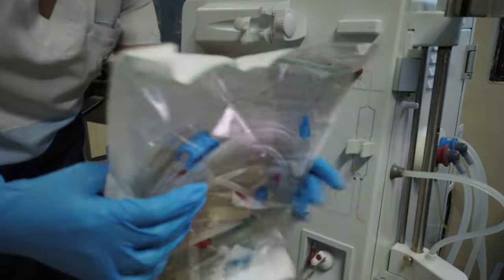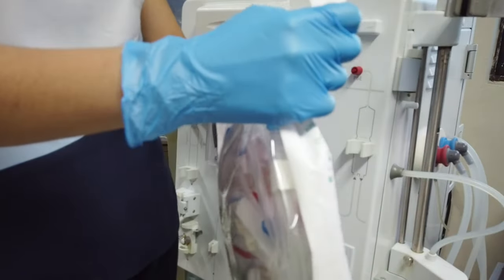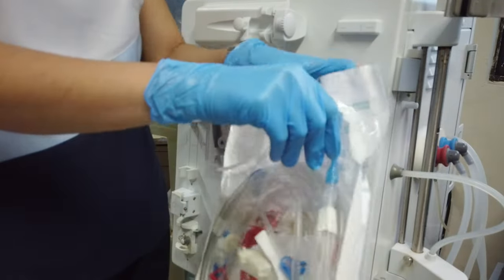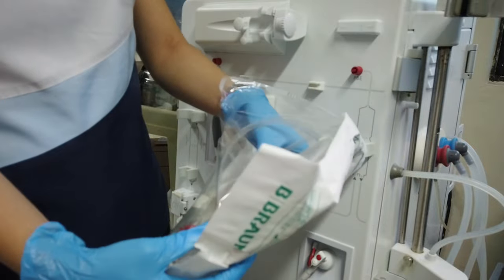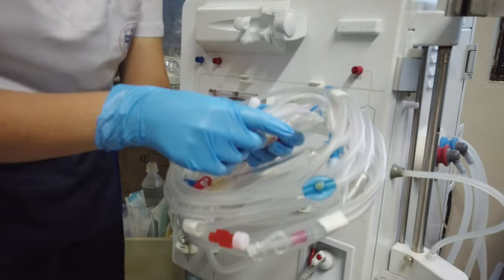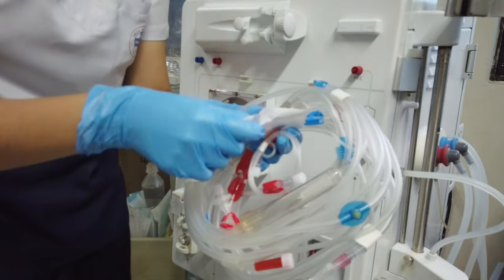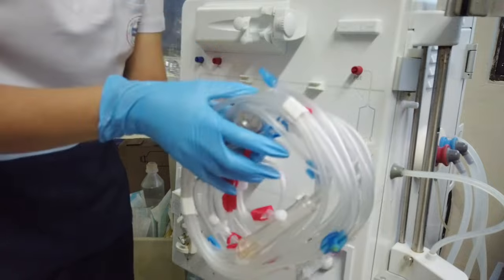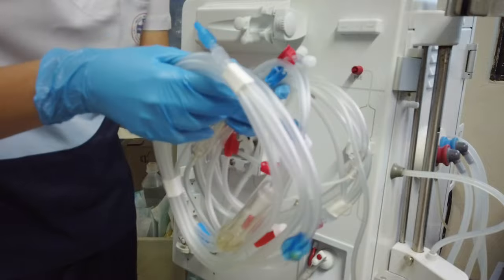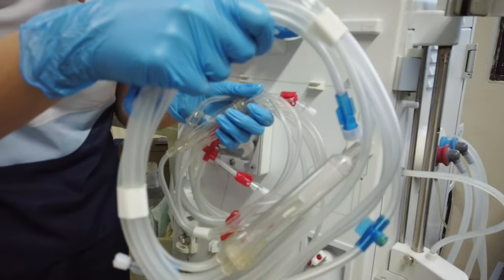So the material we need is a pack of bloodlines. This is Diastream bloodlines, designed for the Dialog machine, which is the machine that we are going to prime and set up, the B. Braun Dialog machine. This pack of bloodlines comes with first the infusion line, then second is the luer lock, then of course the bloodlines. So we have here the blue ones and the red ones. Red for arterial and blue for venous.